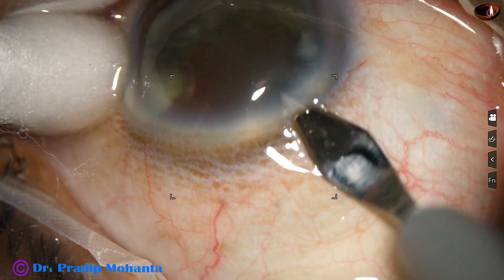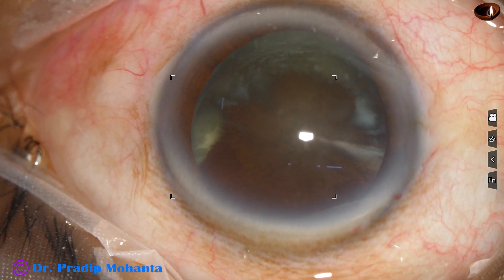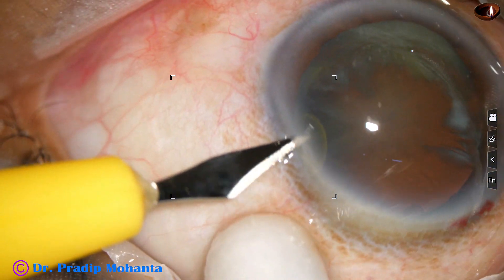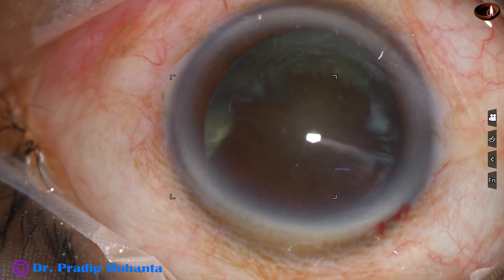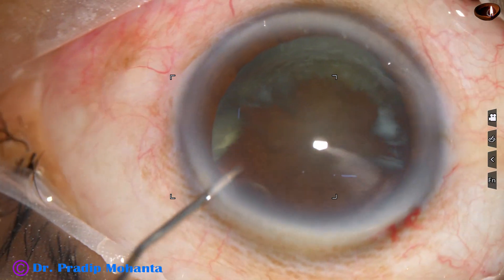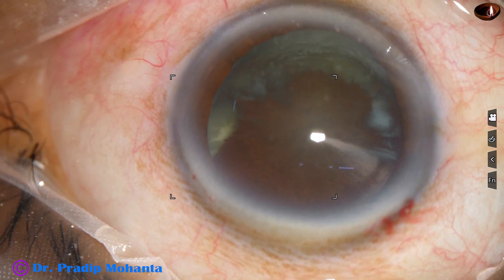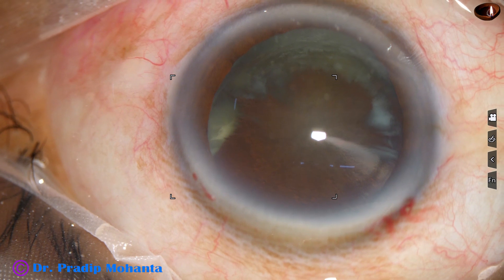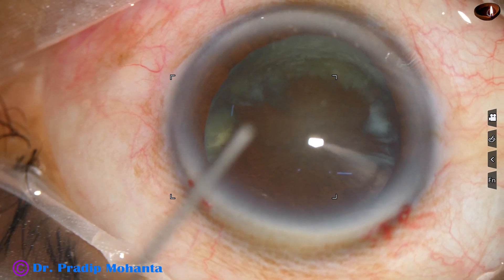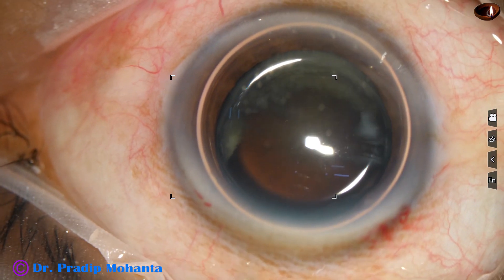Let us observe this edited surgery, edited to show some steps in slow motion. The main incision has been made. This is a side port on the left side of the main incision. Now an air bubble is injected into the anterior chamber — the cannula was blocked, so it was changed, and then the air bubble is injected into the anterior chamber.